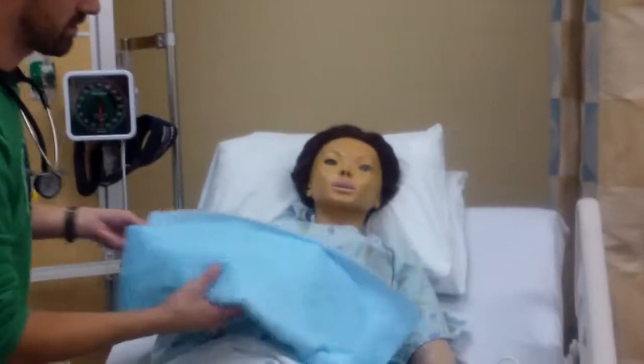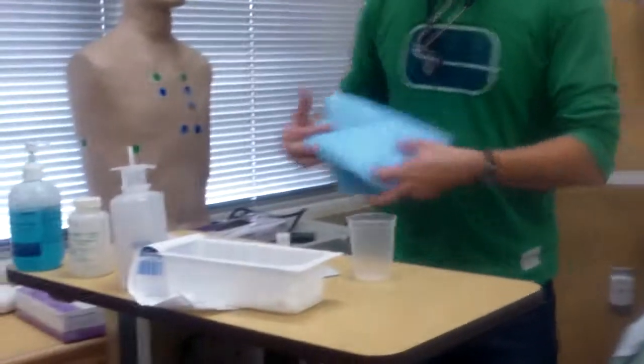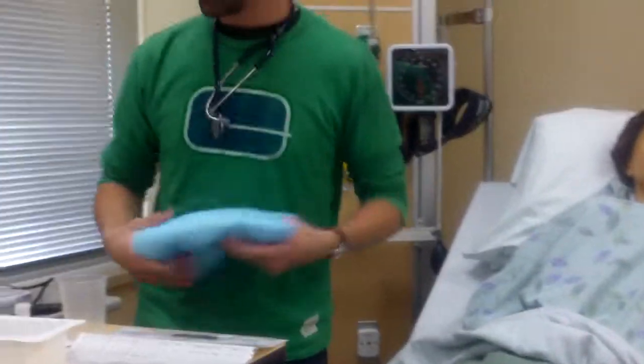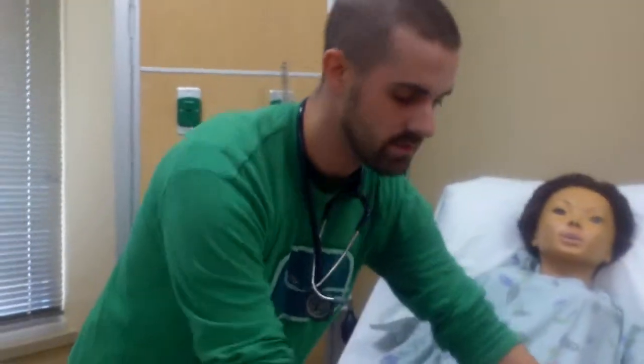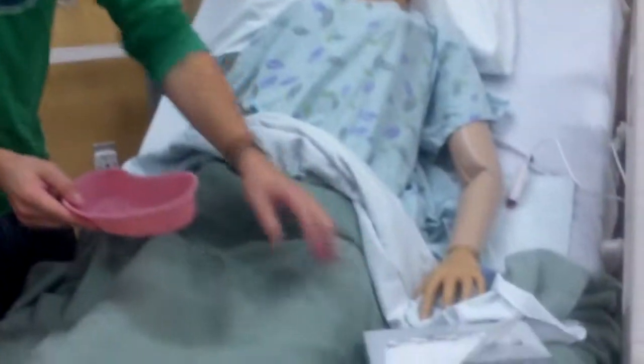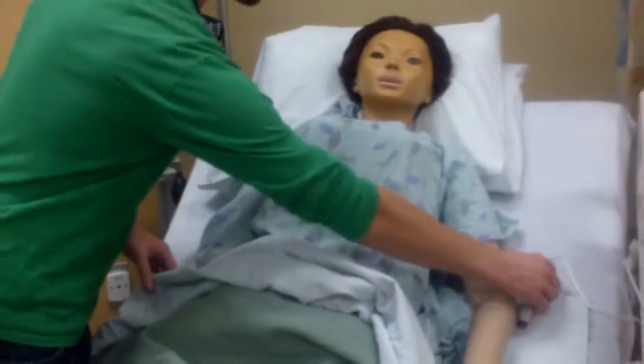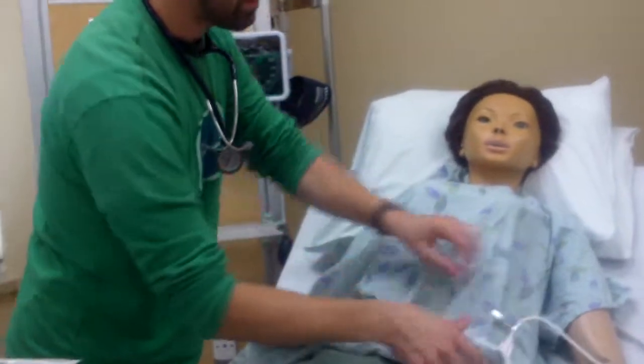I would see if they need any other kind of services, if they need help to go to the bathroom or other. I would need to clean up my mess, take the chucks off. It's good. I would obviously need to document my MAR, what I did, and document how much I flushed with, which was 60 mLs. Take this, and they need the Kleenex for later, so I'm going to save that for them. Their call light is well within reach. I'm going to pin that back on them. See if there's any other thing I can do for my patient.